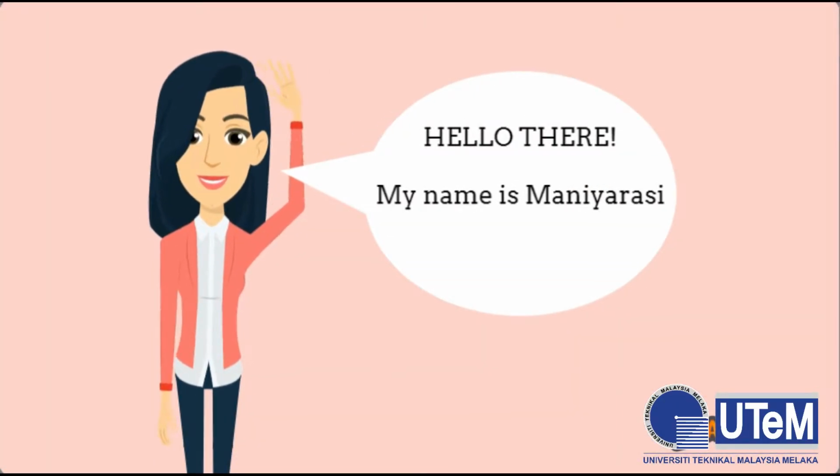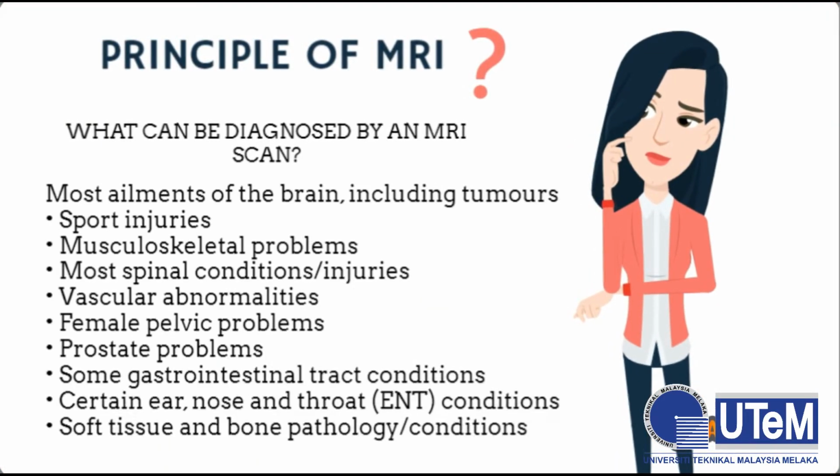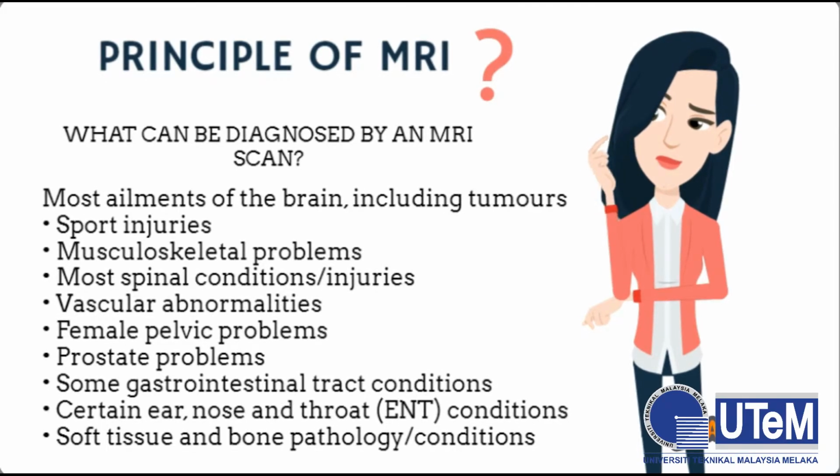Principle of MRI. What can be diagnosed by an MRI scan?